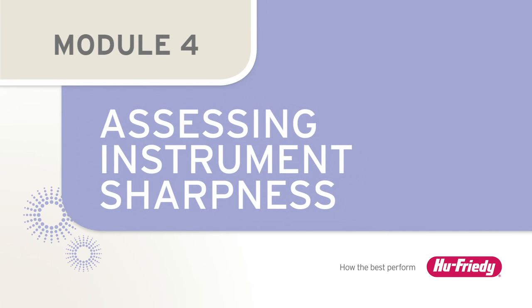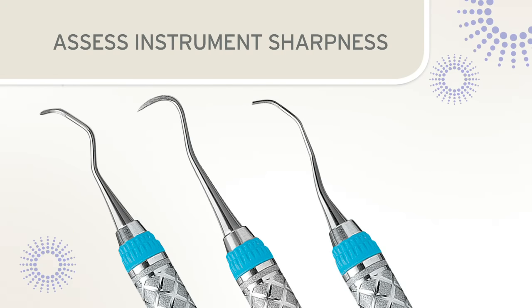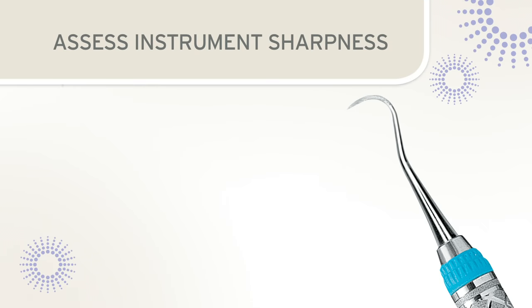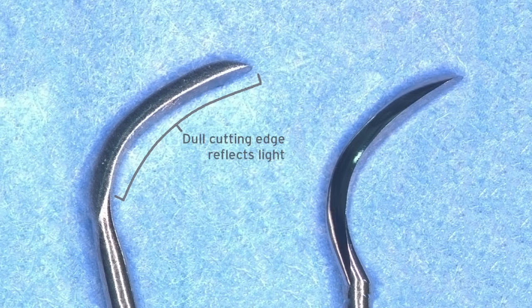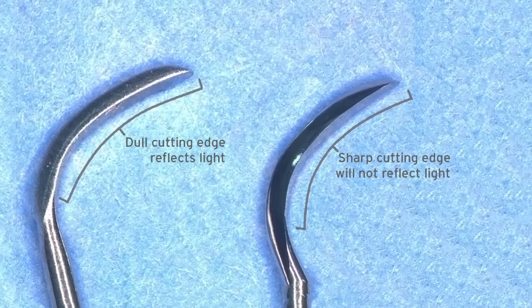The condition of the instrument blade should be evaluated both before and after sharpening. Before sharpening, the blade should be evaluated to determine the extent of dullness — some instruments may require light sharpening while others may need more reshaping and reconditioning. Two methods are available to determine blade condition: the visual inspection or glare test, and the plastic test stick. To visually inspect a blade, hold it under a light and rotate the instrument until the edge faces the light. A dull cutting edge will reflect light when rounded from use; a sharp edge will appear as a fine line that will not reflect light.